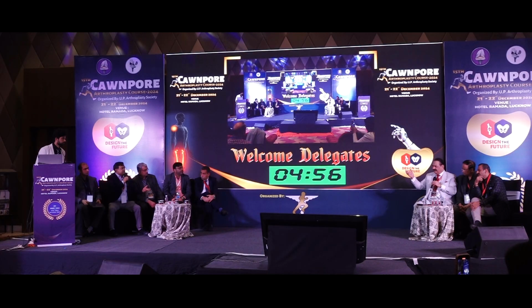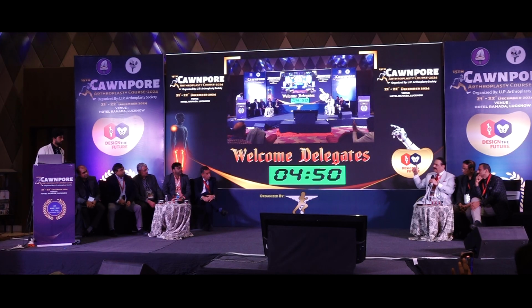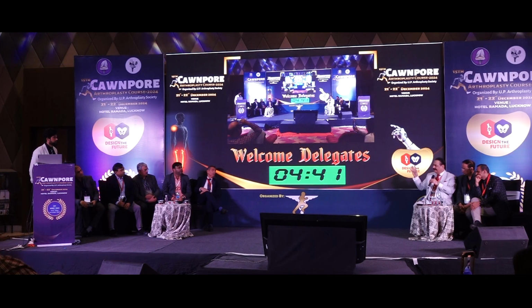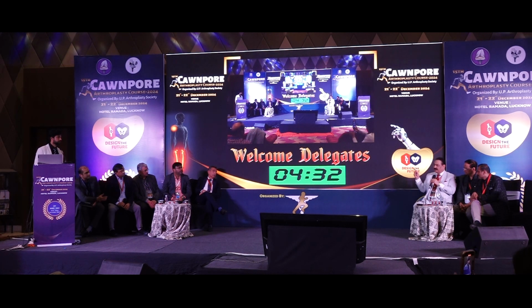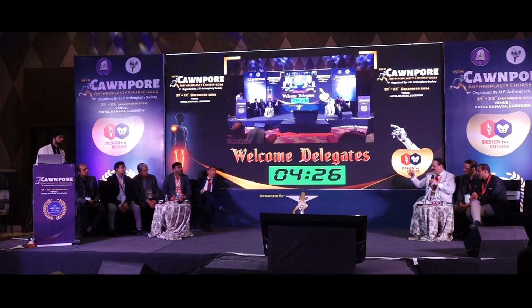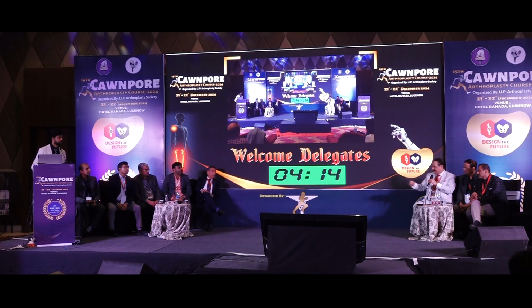Still, they usually come back. They recover very well. And I'm observing you had kept S-ROM in backup. Yes, sir. Why S-ROM? Because the femur was fine, absolutely fine. It was the acetabular side which would have been damaged if the surgeon had done an improper kind of resection arthroplasty. The femur was quite okay. Sometimes surgeons keep S-ROM if they anticipate difficulty on the acetabular side, to play around with the anteversion. That's the only advantage. Suppose we keep getting tubercular destruction in India on the acetabular side, and you are not too sure how the version is. Sometimes you use S-ROM for acetabular reasons, to play around with the version.